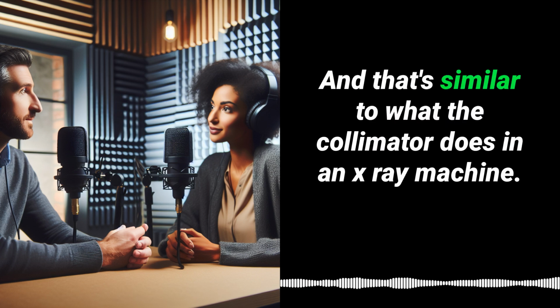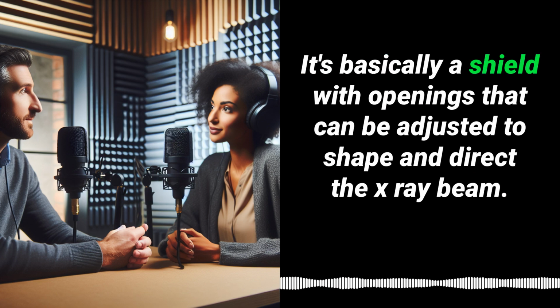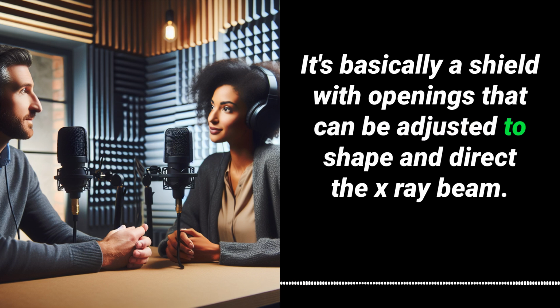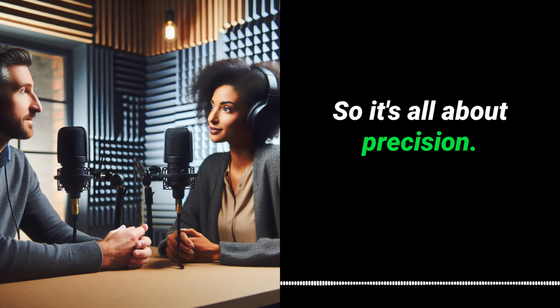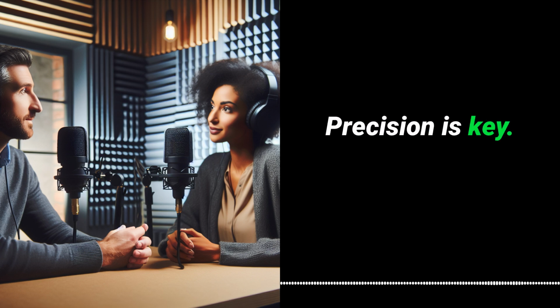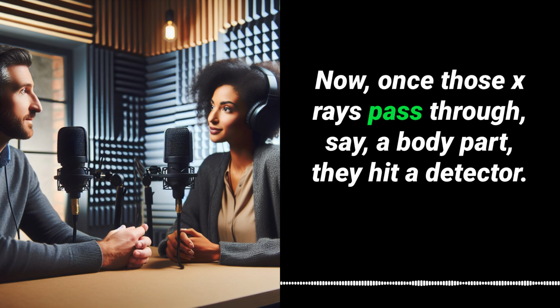Exactly. And that's similar to what the collimator does in an X-ray machine. It's basically a shield with openings that can be adjusted to shape and direct the X-ray beam. That way, the X-rays hit the right spot, and we're not just flooding the room with radiation. So it's all about precision. Exactly. Precision is key. Now, once those X-rays pass through, say, a body part, they hit a detector.